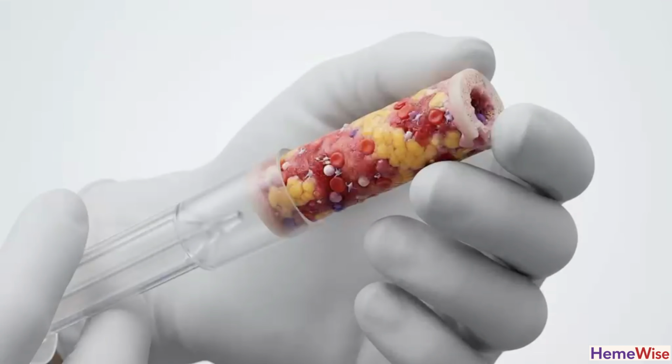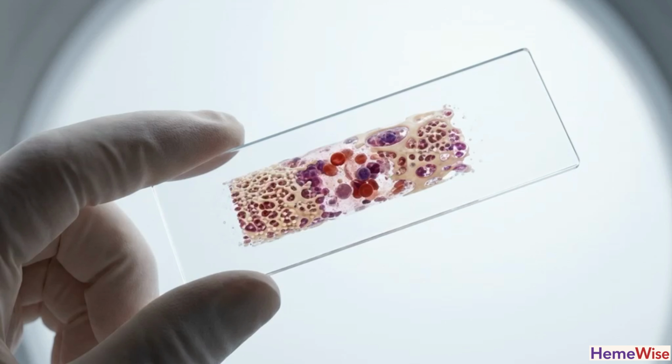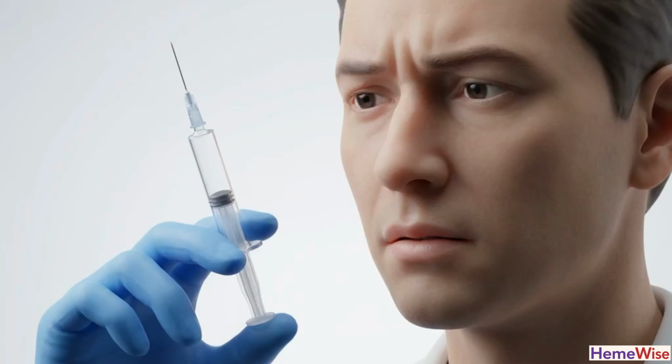When an aspirate fails, we rely on the trephine core. By rolling the fresh biopsy core directly onto glass slides, we create touch imprints that salvage the cytological detail from cells on the tissue surface. A technical extraction failure is frequently the first indicator of significant underlying pathology.